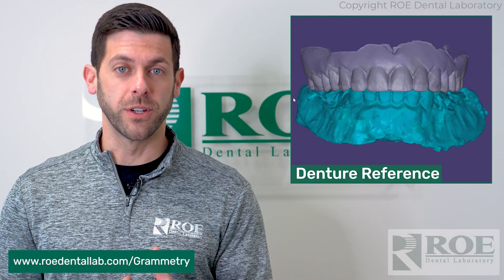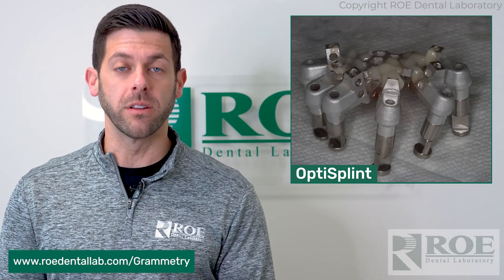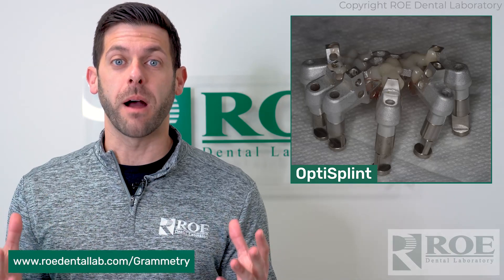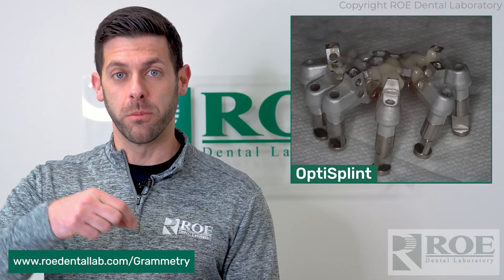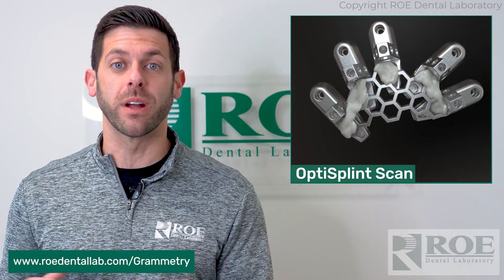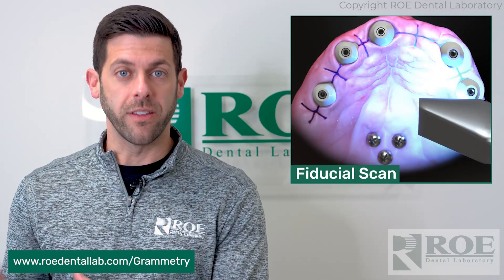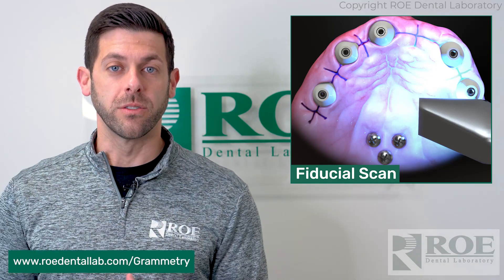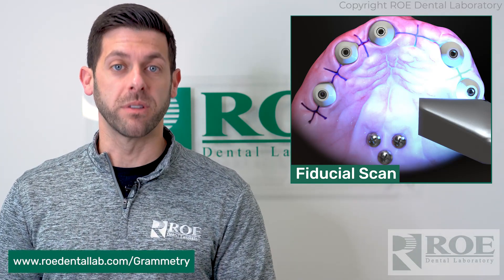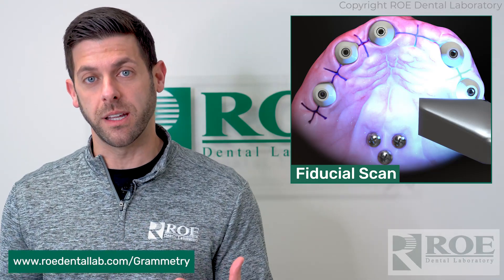Along with all these fiducials is the opti splint. It goes in the mouth post-surgery and connects direct to the multi-unit — you screw them in and lute it together. The nice thing about the opti splint is that once it's luted together, you remove it from the mouth, grab your fiducial scan, and then scan the opti splint outside the mouth. So it's much easier — just use your intraoral scanner to scan your fiducials and the healing caps, then scan the opti splint. We mesh those together to get the tooth position and multi-abutment positions and create a great-looking prosthesis, which you can print in office or we can print it here and send it out to you.